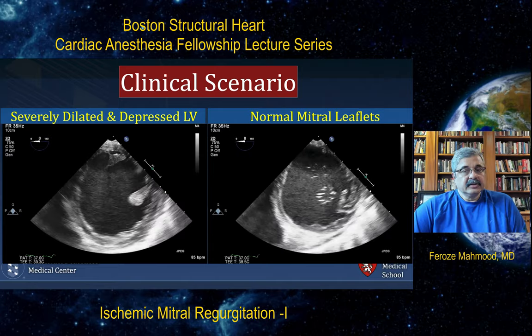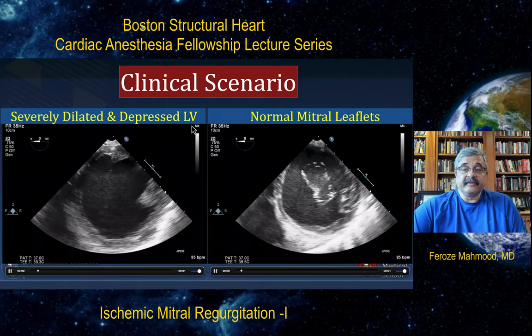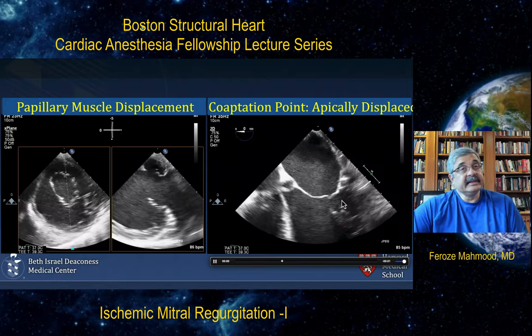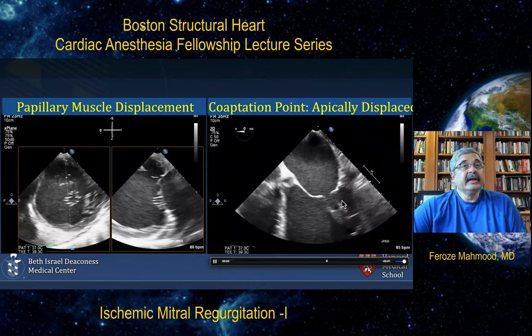This tethering and apical displacement of the coaptation point in two dimensions is seen either as tenting height — the distance between the plane of the annulus and the point of coaptation, normally about 0.6 centimeters; anything more implies significant leaflet tethering — or tenting area, the area subtended under the mitral annulus. One centimeter squared is considered normal, and anything beyond that is considered an abnormal tenting area.